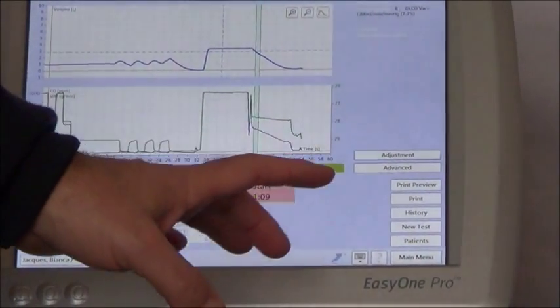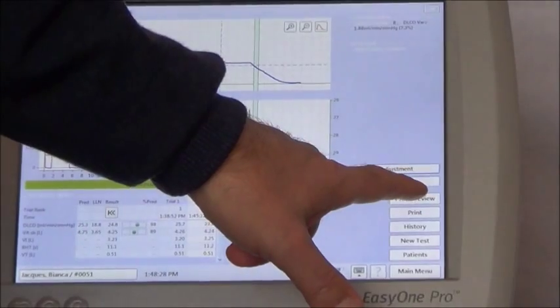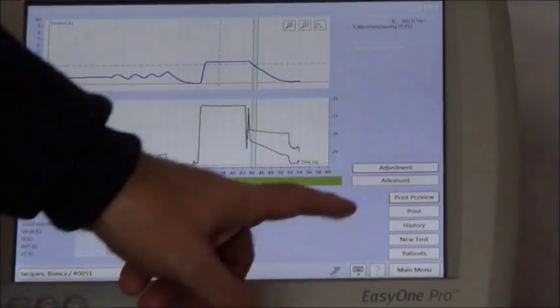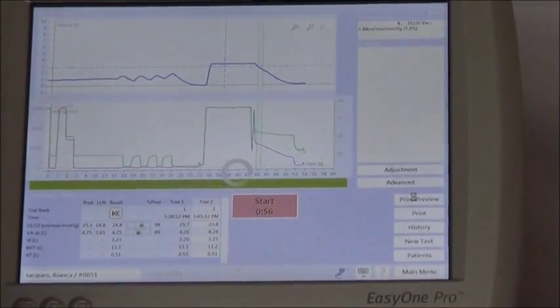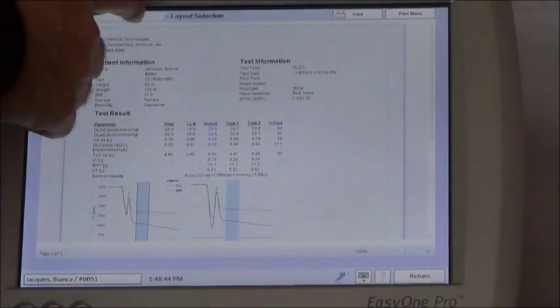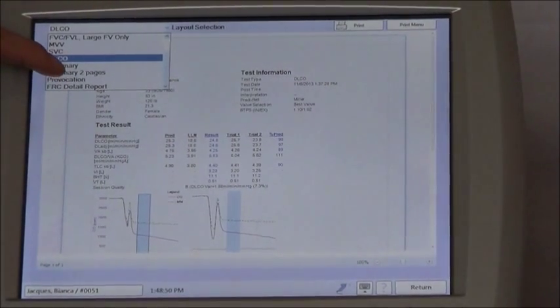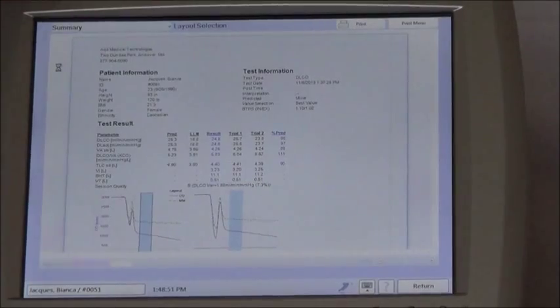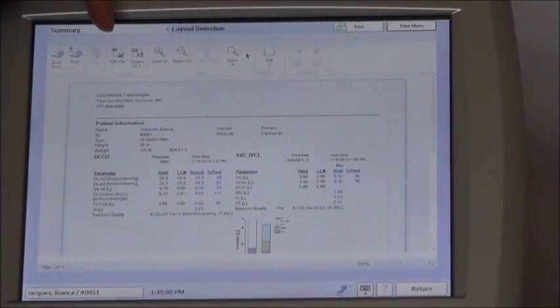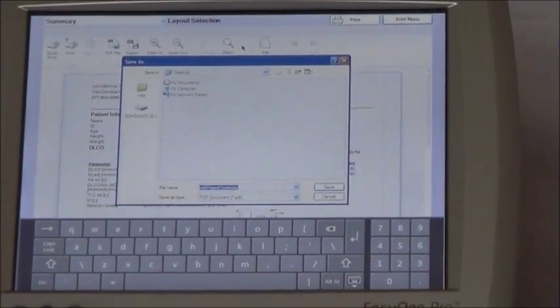When you're done the test, most people want to print or save the results as a PDF or something. So I'm going to press the 'Print Preview' button. That's going to bring me to a print preview of the DLCO test. Here I have templates to choose from — I could choose different layouts. There's a two-page summary that's popular. From here you can print the results to a printer, or there's also the ability to save the file to a PDF. That's how you would either print or save the test when the test is done.